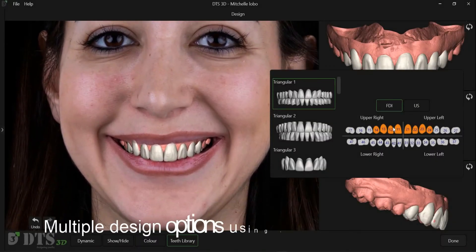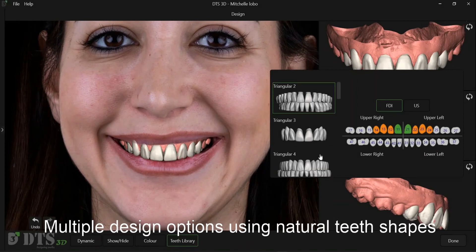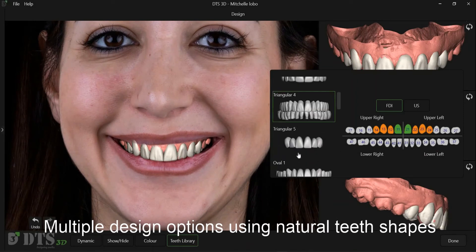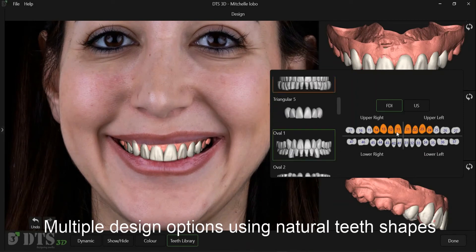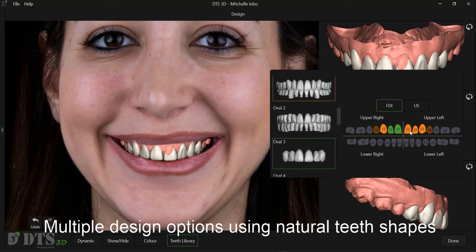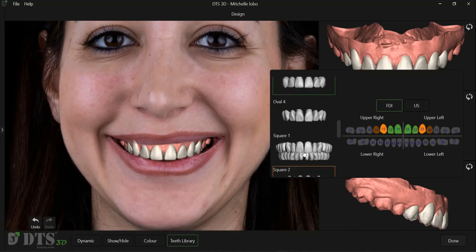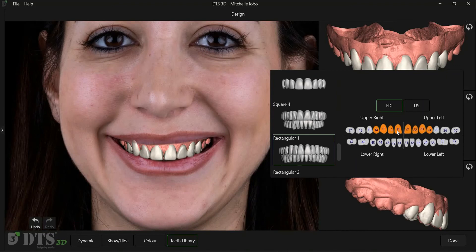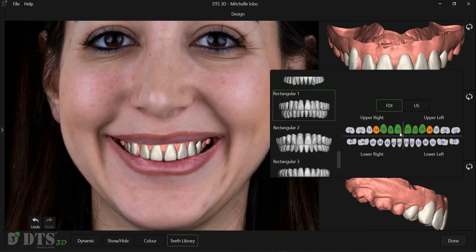The Automated Design screen recognizes the positions fixed for the teeth shells, and allows adding different teeth libraries in the same fixed position. We can easily show patients different teeth shape options on their smile, and make them a part of the decision-making process.